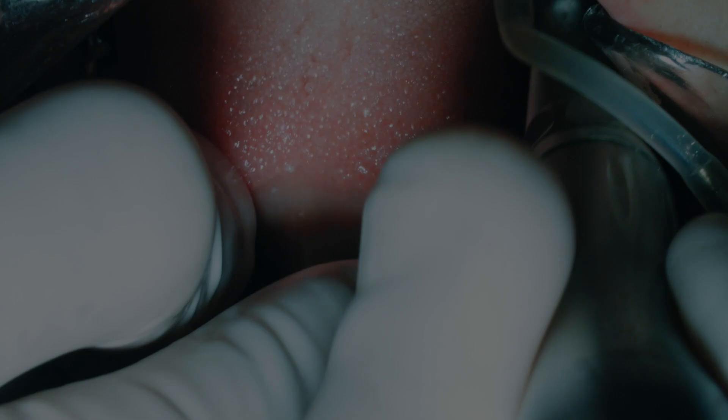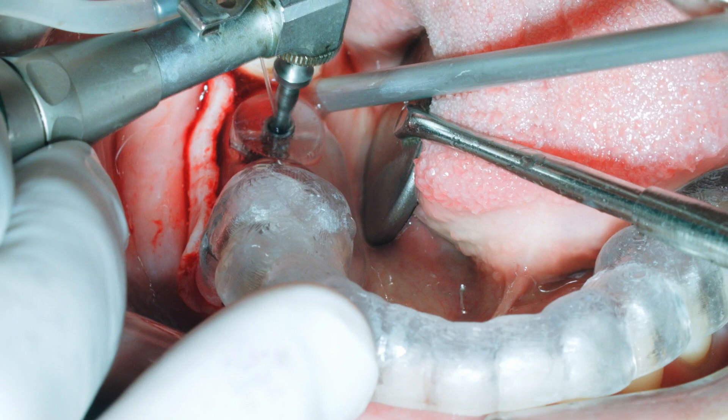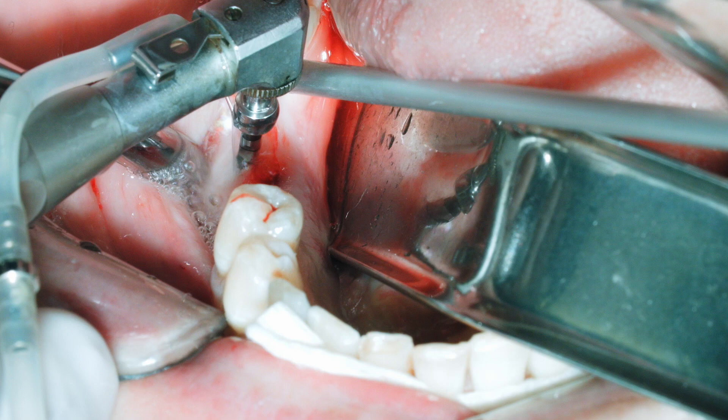Our next case is a mandibular posterior case using a guide for the initial site preparation at the mandibular left second molar. A flap has been elevated before preparation has begun on the right side for the first and second molar replacement. The pilot guide is used and then we'll go to the two millimeter twist drill from the surgical kit. The top of the first thick black line is 10 millimeters and we can see the number two multi-drill going to the full depth.